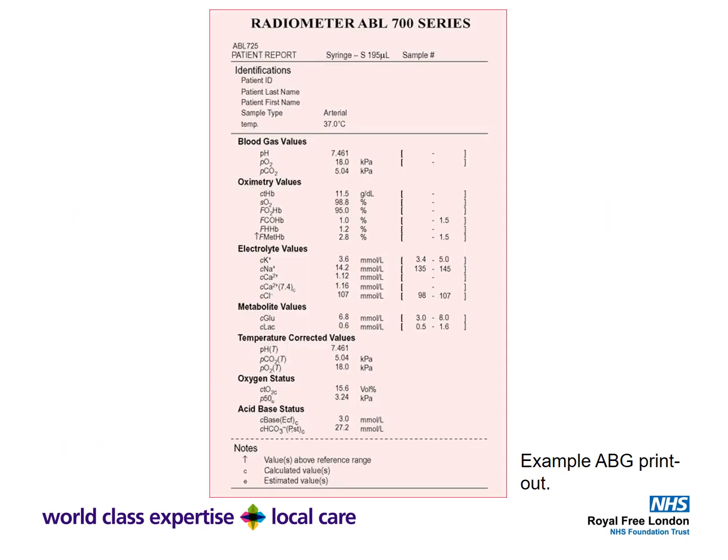Just to give you a rough idea about what happens when an arterial or venous blood gas is handed to you, these are the different types of values that you'll get. This is a very typical ABG printout from our Radiometer machines, which we also have here at the Royal Free, and you can see that you would have the patient details. The sample type is very important, whether it's arterial or venous, and of course how much oxygen they're on, which I'll come to in a moment.